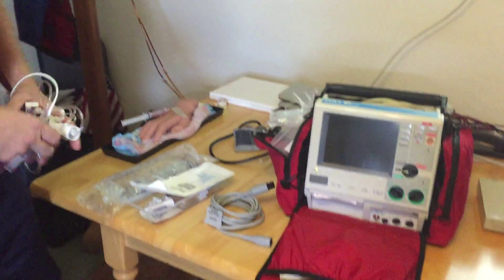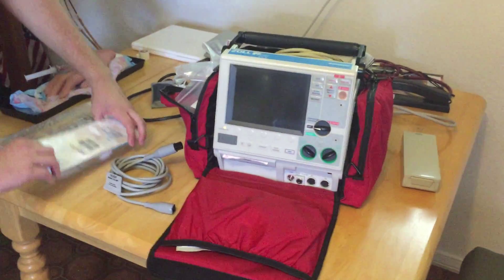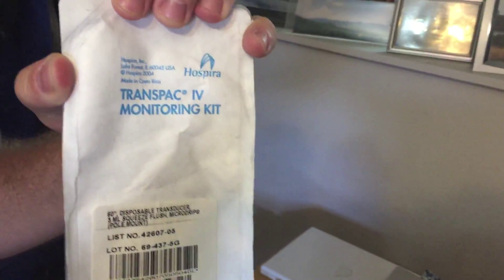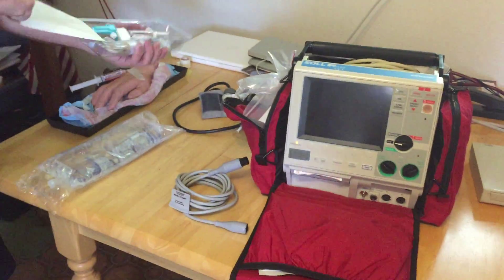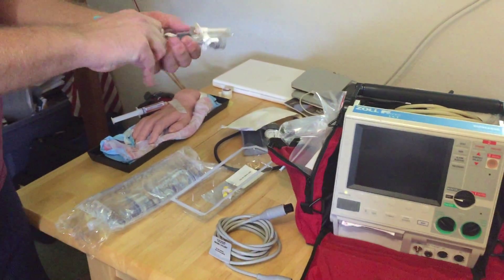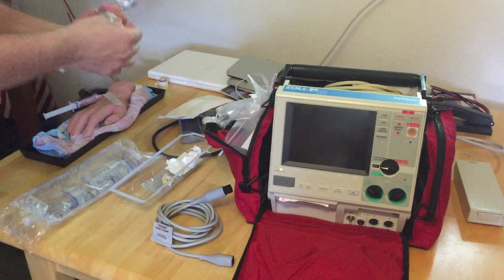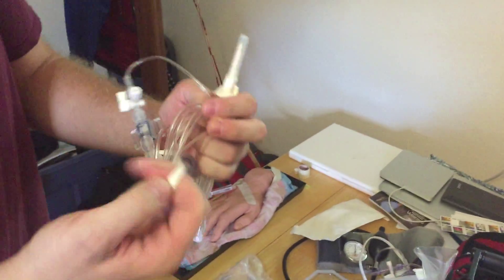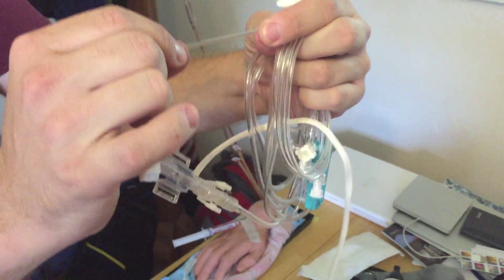It has a little oval connector there, but we won't actually be able to use this one today. What I have is a TransPak monitoring kit — an invasive line kit that I'll be using. The invasive line kit contains tubing that has what's known as a transducer. Here's my tubing, and you'll notice a couple of things. It's really hard to tell in the video, but this tubing is very stiff and it is very low compliance — non-compliant tubing.